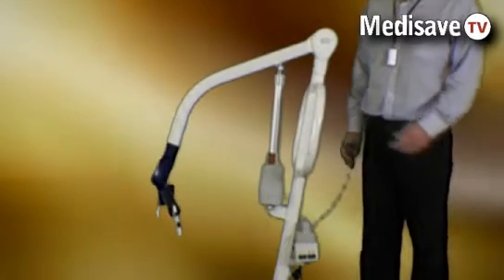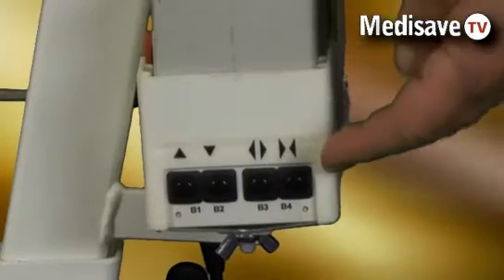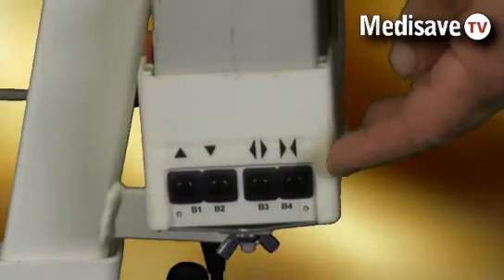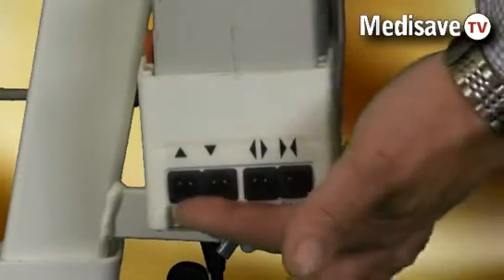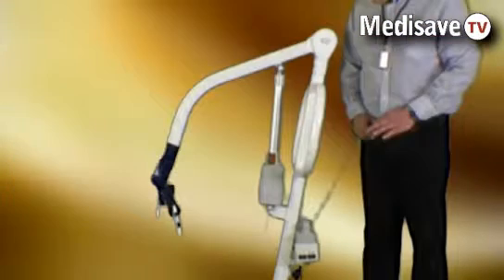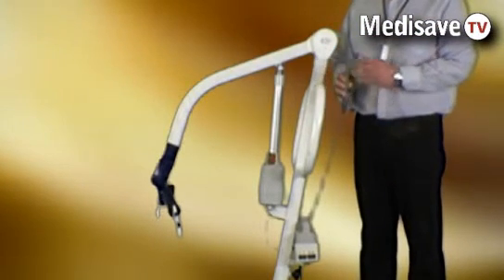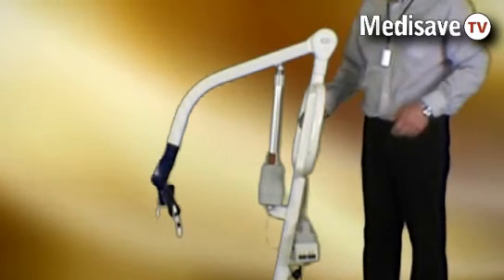The locomotor hoists feature a second set of control buttons which allow the hoist to be operated from the buttons on the side. This is in case of a problem with the handset, meaning there is always a way of operating the hoist in any circumstance.